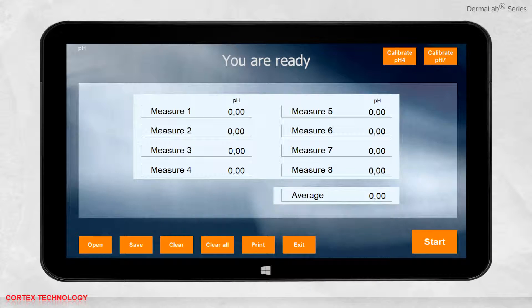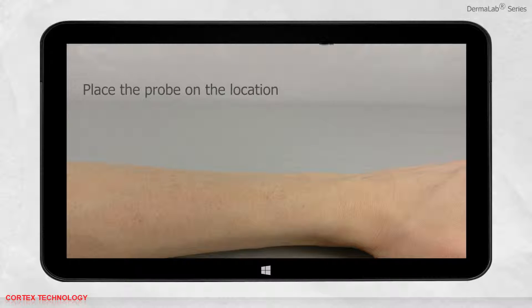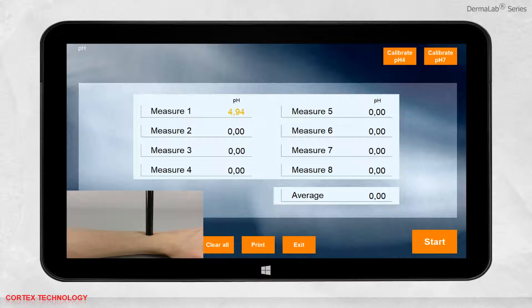Now you are ready to perform a measurement. Place the probe where the measurement should be performed and press start. Hold the probe on the location until the measurement is complete and the display turns black.